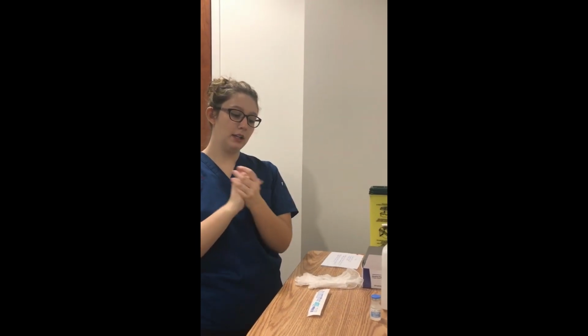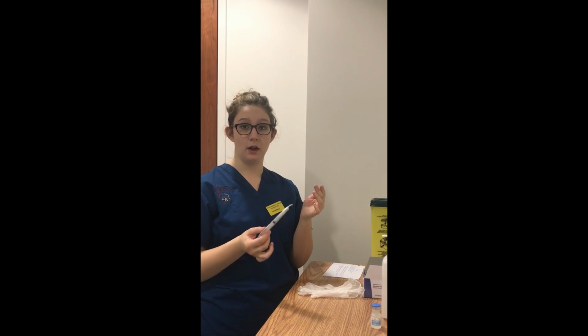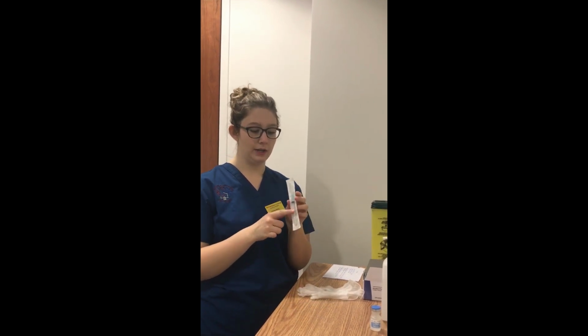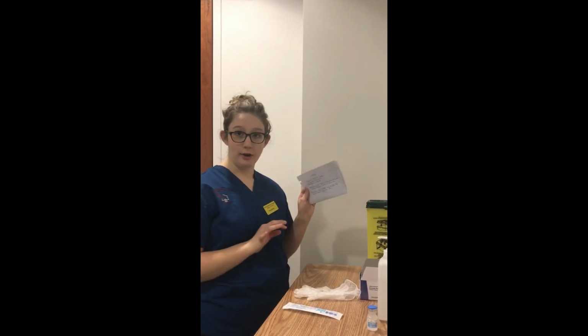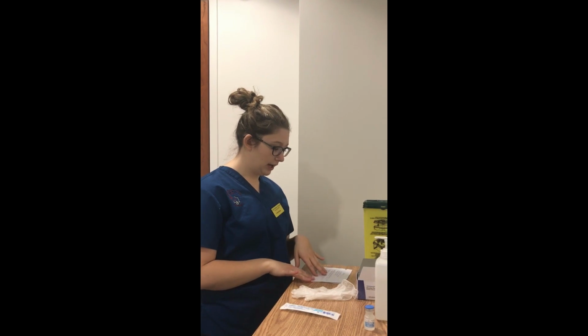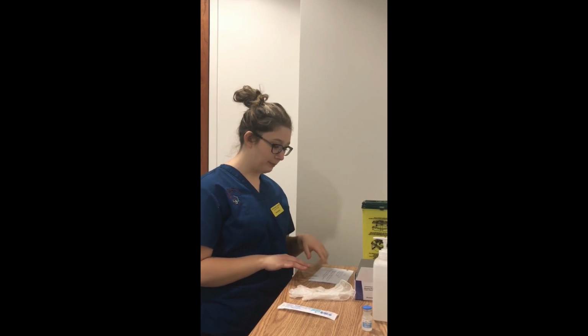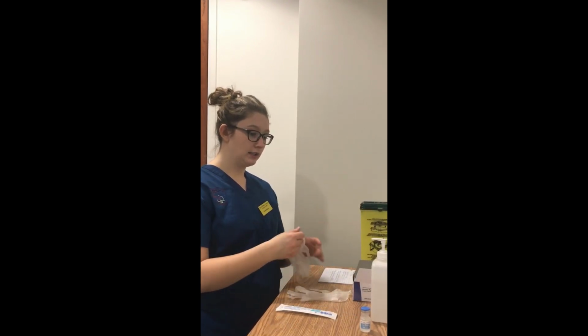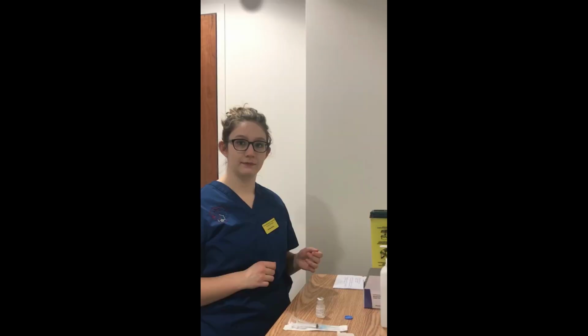Before I start the subcutaneous injection, the needle that I will be using is already put together, but in a hospital when it's not put together, the needle and the syringe are separate and you simply screw them together. I've checked my MAR, and I will be administering 1 ml of heparin. This is a brand new vial, so you just pop the top off. If it was not a new vial, then I would use an alcohol swab to clean off the top.